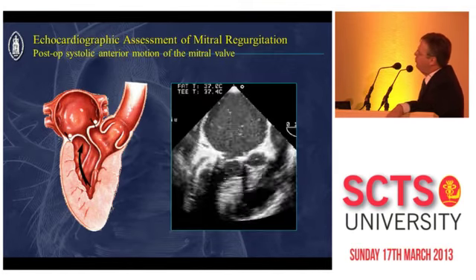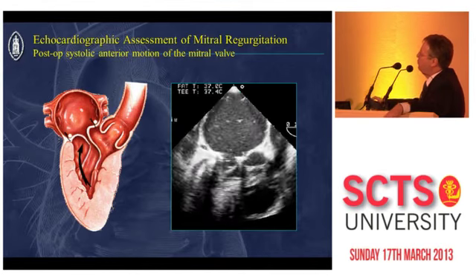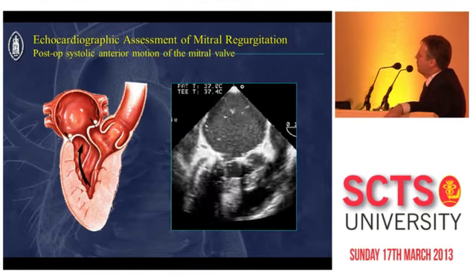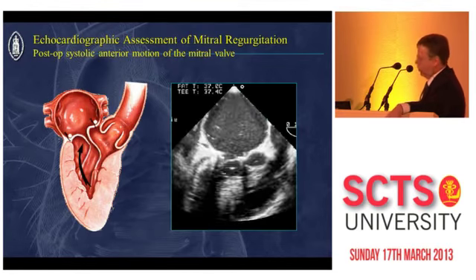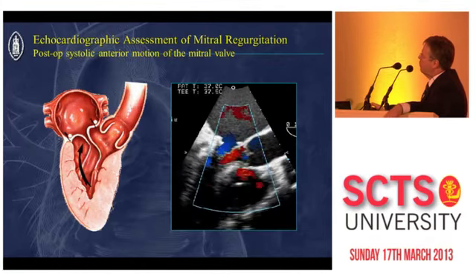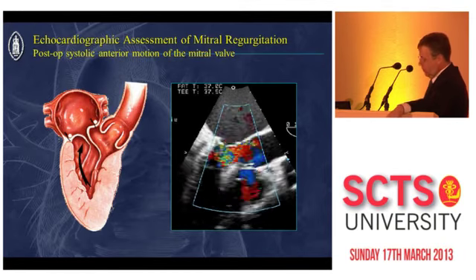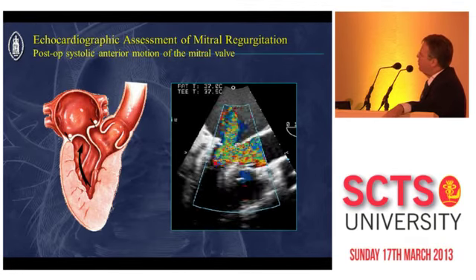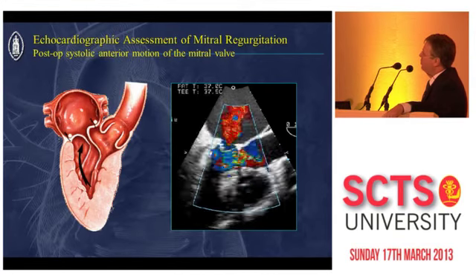It should not be confused with this. This is immediately upon, not even weaning from bypass, the heart is starting to beat, is completely empty, and you have a SAM which is more or less a pseudo-SAM. And of course it also leads to mitral regurgitation and a gradient in the left ventricle, but if you fill the heart and stop the inotropes, these can disappear and you do not need to do anything about them, with usually very good prognosis.